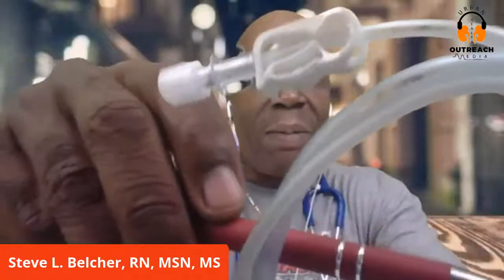Right there, you see that opening inside? The blood has to freely flow down. If it doesn't freely flow down, like I said, it could pool at the top, thus putting you at risk to clot. It can form a clot right up there because the blood is not flowing down freely.